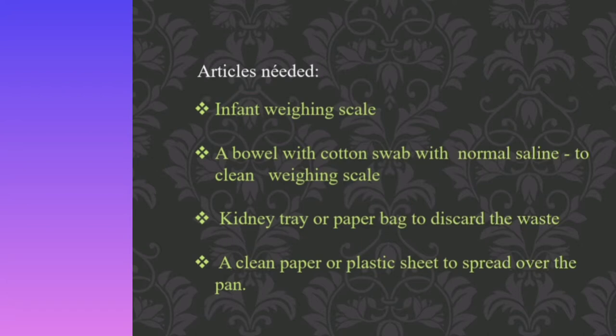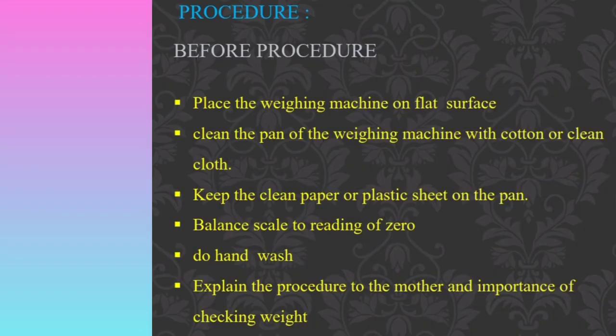Let us see the articles needed for the infant weighing procedure. These include: the infant weighing scale, a bowl with cotton swabs and normal saline to clean the weighing scale, a kidney tray or paper bag to discard waste, and a clean paper or plastic sheet to spread over the pan.